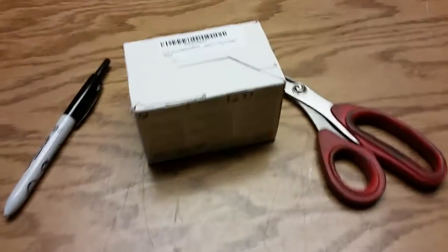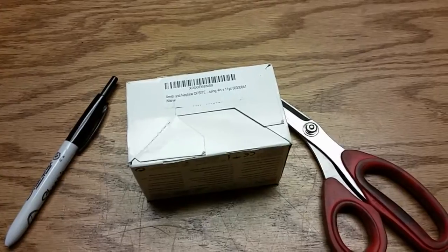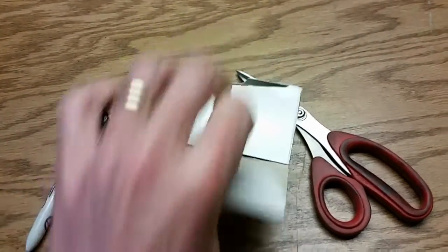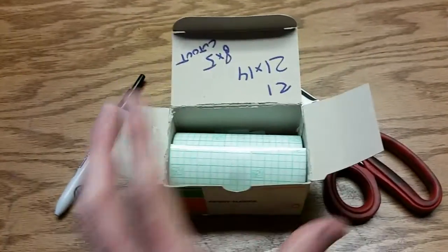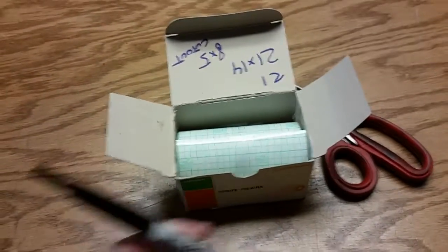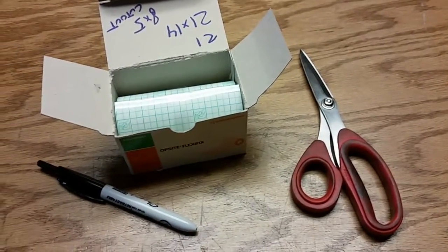So what I recommend you get is this stuff, the Smith & Nephew Opsite. I got it in a 4-inch wide by 11-yard long roll, and I haven't gone through very much of it yet. I bought this stuff on eBay. It was relatively inexpensive. Basically it's a very thin tape that they use to put IVs on people, so you've seen it before. You'll need that, a fine tip marker, and a pair of scissors, and that should be about all we need. So I'm going to show you how to do this.